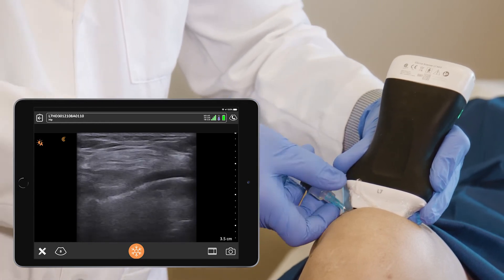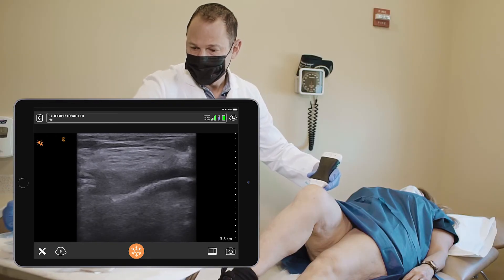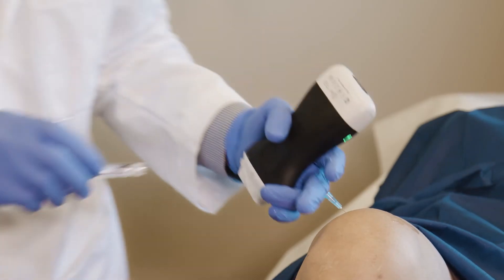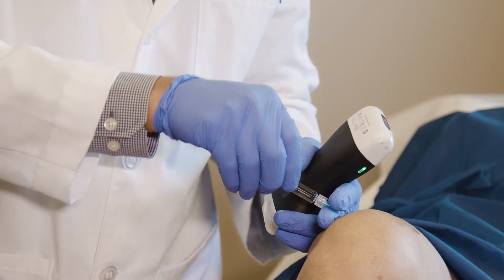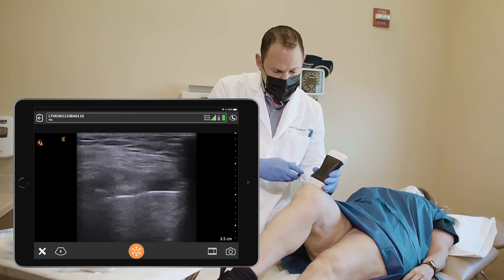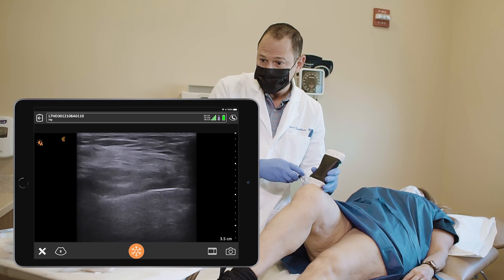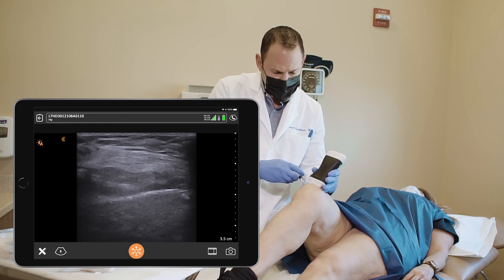Am I hurting you, Rosie? No, I'm not. Okay, good. The needle is in the recess and the injection is going in smooth.